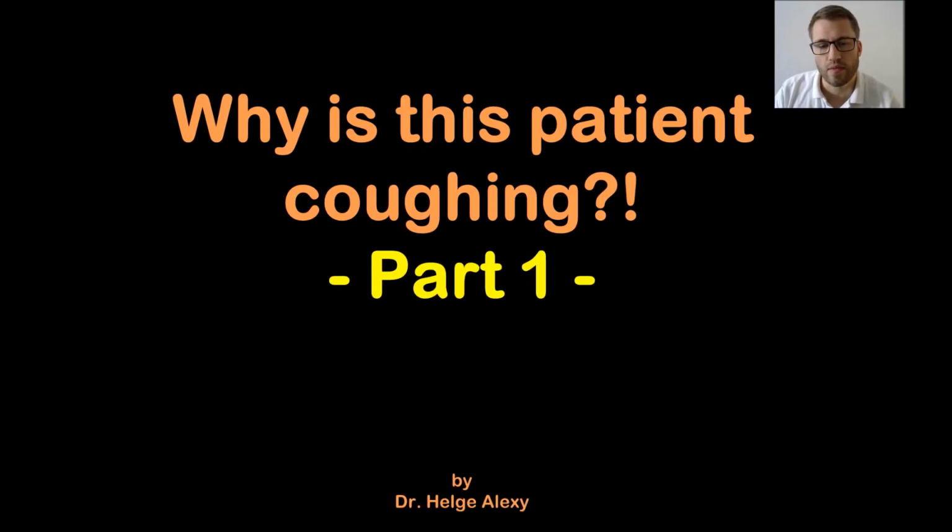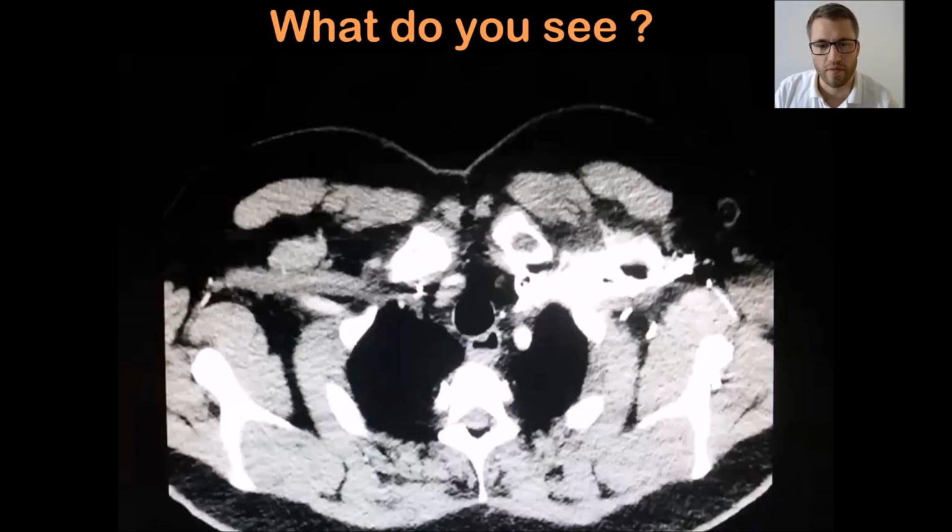The reason why I divided this case into 2 parts is that the patient had so many pathological findings in the transthoracic and transesophageal echo we performed that it would exceed the time of one video. But now to this first case.